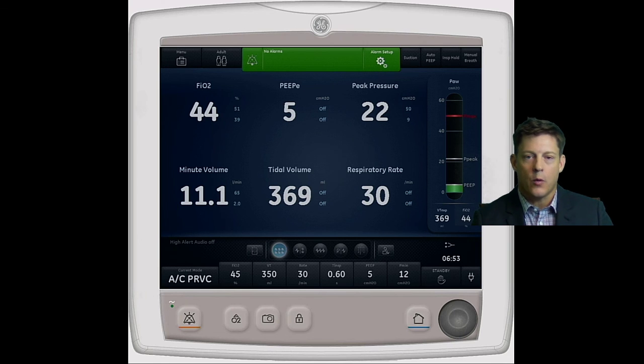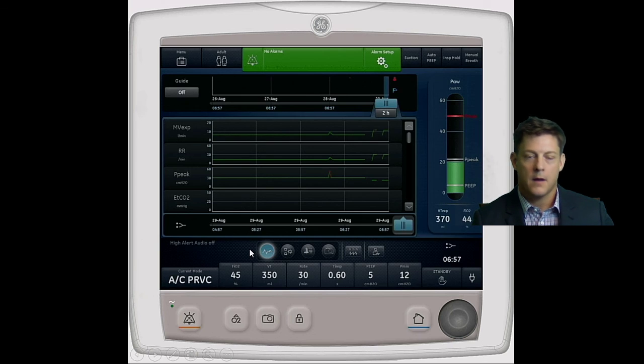So now I'm going to move over to the left, or the past. And when I move over to the left, I'm going to open up this workspace, and it's going to close my present workspace. I open that up. You notice that my present workspace collapsed. And this is just giving me four views associated with the past or historical trends. My first view is what's called my basic graphical trends.